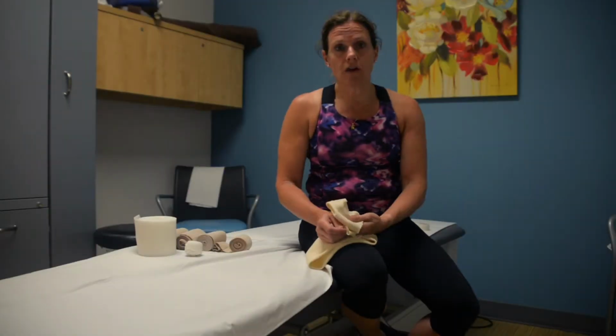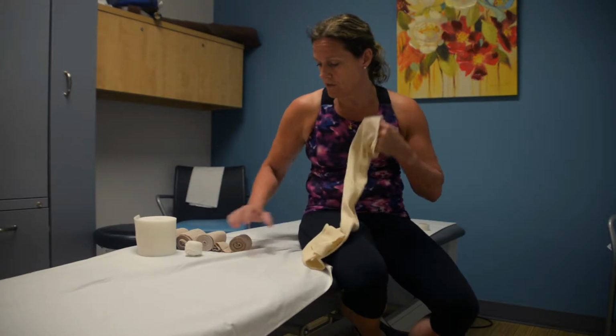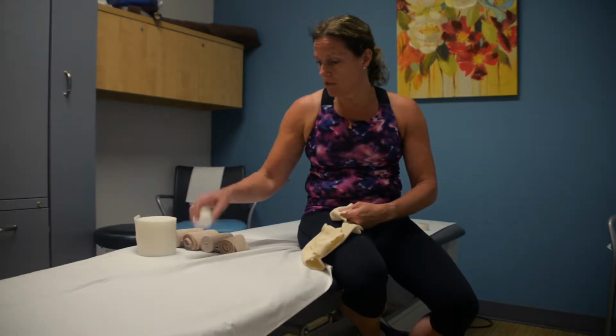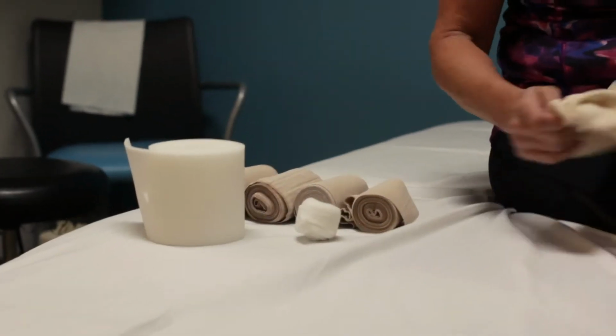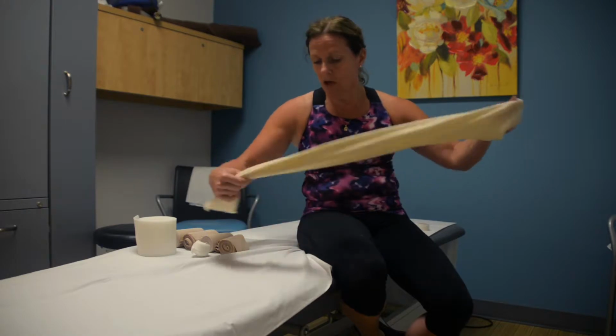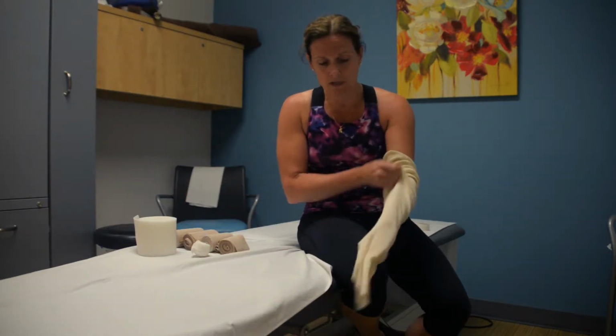Today I'm going to teach you how to do self-bandaging for upper extremity lymphedema. I've already got my bandages laid out for me, my finger bandage, my foam, and my short stretch bandages. I also have a couple of pieces of tape over here. So, first thing you're going to do is put on your stockinette.